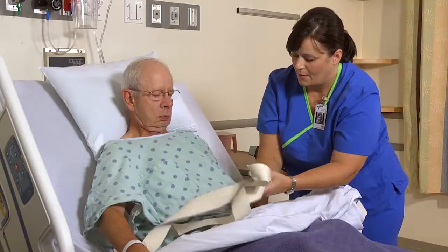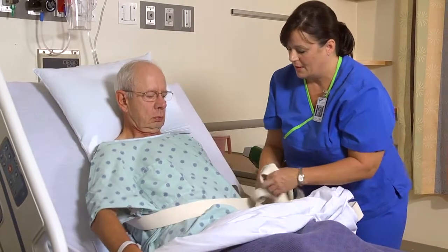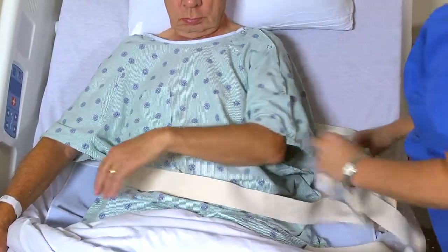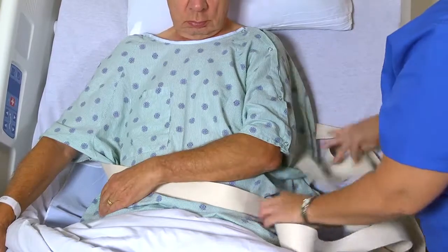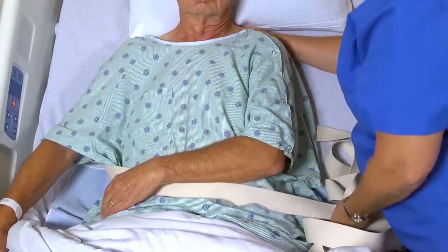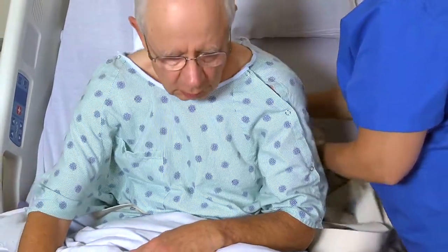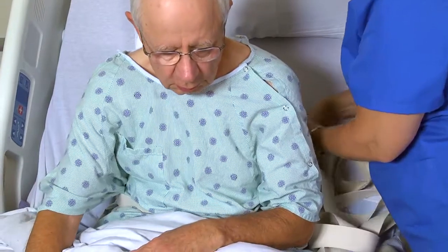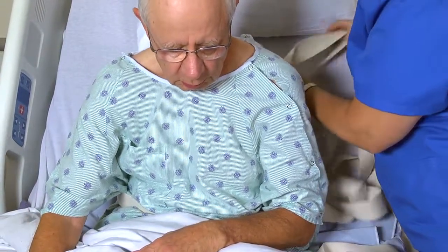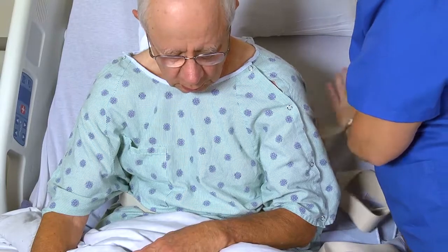Position the restraint at his waist and not over his chest or abdomen. Have the patient sit up one more time. Bring the ties of the restraint through the slots in the belt. Avoid cinching it too tightly.